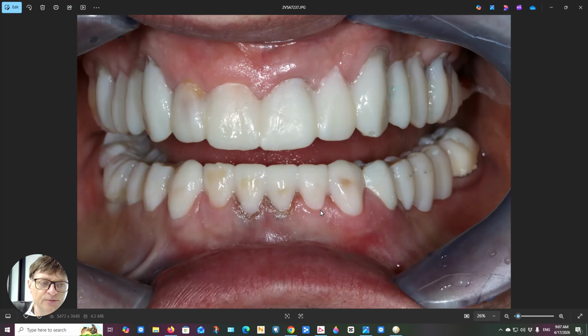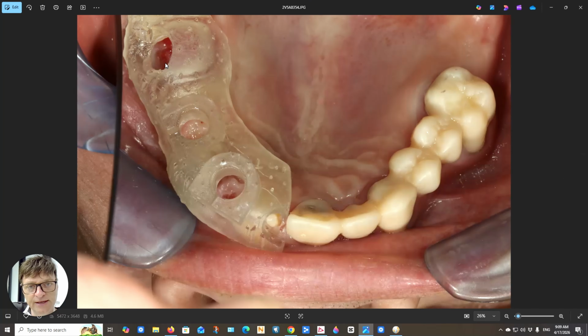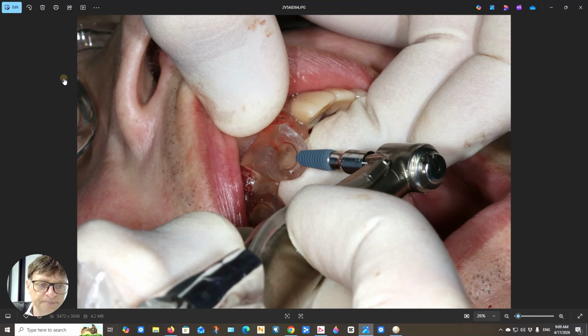We then proceeded with the implant surgery using digital guides that fit over the teeth. We do it one half first and the next half later, keeping the position of the teeth that we designed in the original plan. We clip these special 3D printed guides into place. Those are the temporary teeth. We just then place the implants through the guide exactly in the position we planned. That's the implant, that's what it looks like. It goes through the guide and it's placed in the correct position.